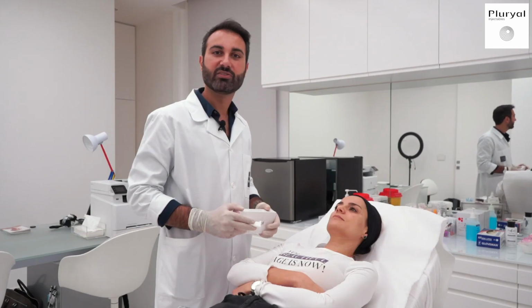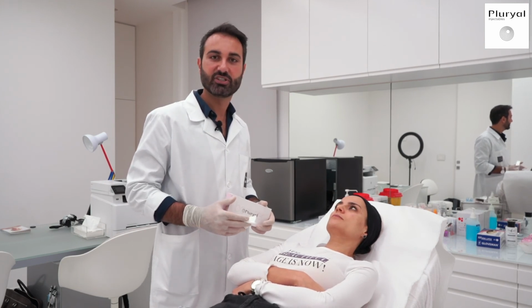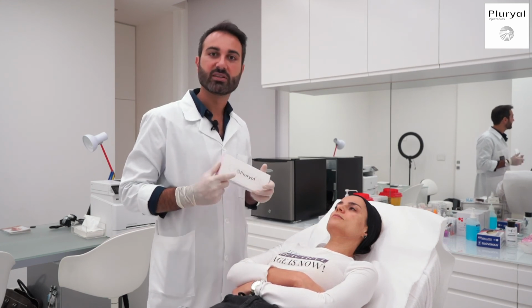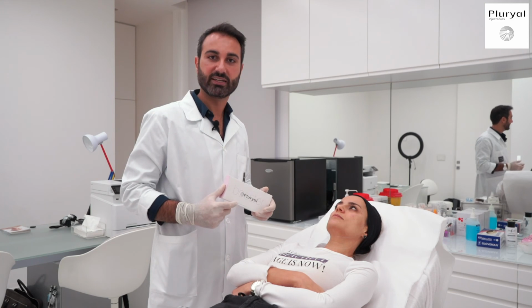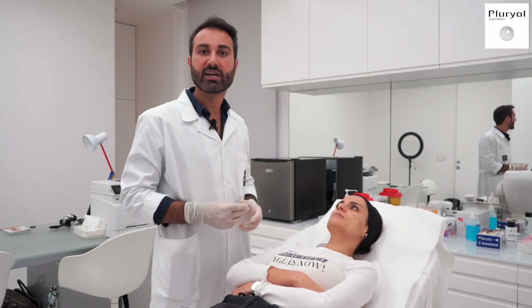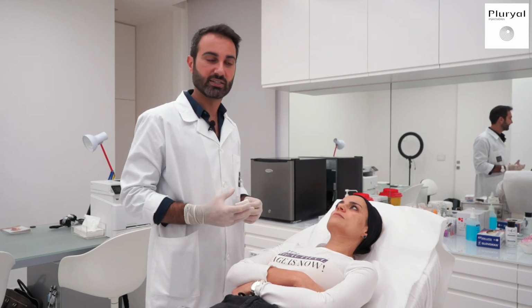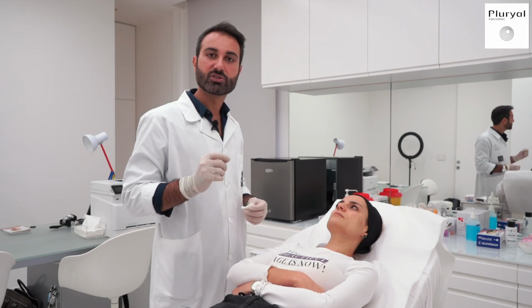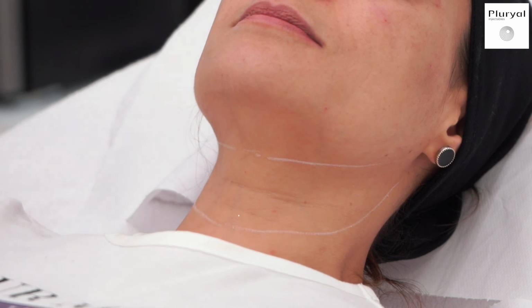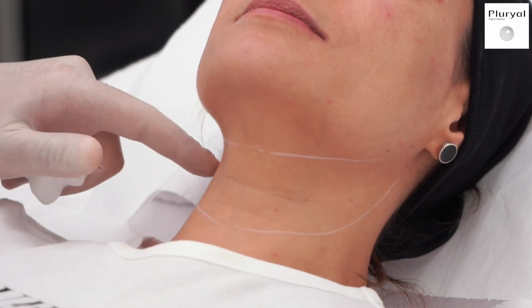Now we have finished the filler treatment. I usually like to wait 2 weeks after this treatment to do skin boosters. But in this case, I will be using the Pluryal booster on the neck. The Pluryal booster has hyaluronic acid that is non-cross-linked, so it's great to hydrate the neck. And you have to do small papules intradermally. In her case, I will be focusing more the concentration on the wrinkles of her neck.